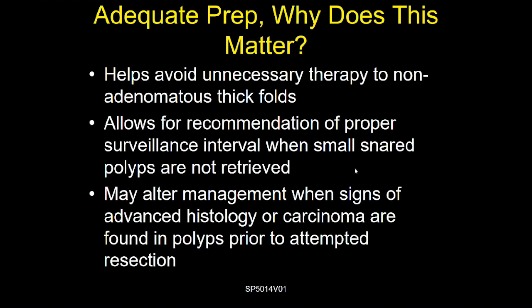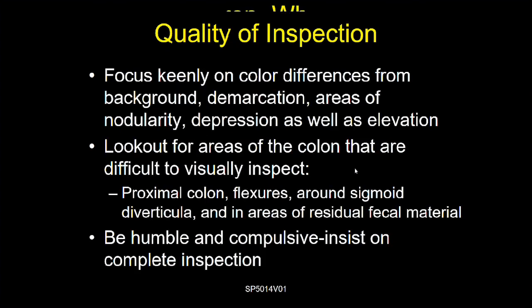So what does it do with this prep? Well, there are a couple of benefits to having a great prep. One is those thick folds. If you can really look at the folds, you make sure that you're not going to snare off a fold that really has normal pit patterns, allowing for recommendation of the proper surveillance. What happens when you snare a small polyp and you might lose it? You have to be able to understand a little bit of what it is beforehand. And then when you see some signs that are warning signs for advanced histology or cancer, this is very important because it may alter your management. Perhaps you'll definitely inject that polyp, or not. Maybe if you think it's a cancer, you won't try to take it out.